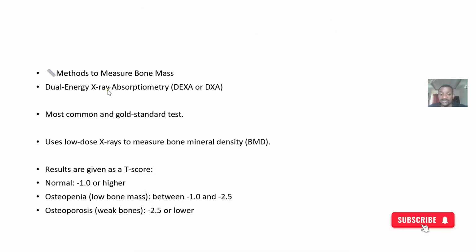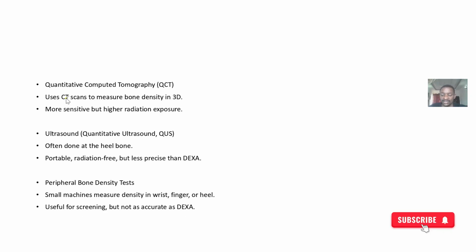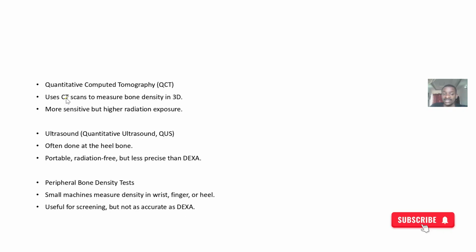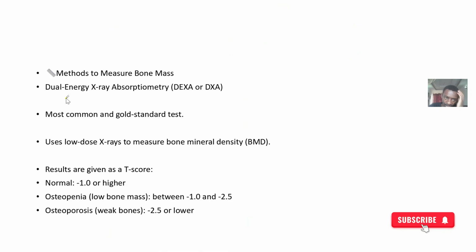So different methods include the dual energy X-ray absorptiometry. We also have the quantitative computed tomography. We have the ultrasound, quantitative ultrasound. We have the peripheral bone density tests. So let's look at them.